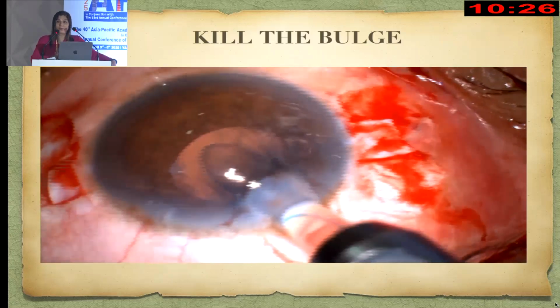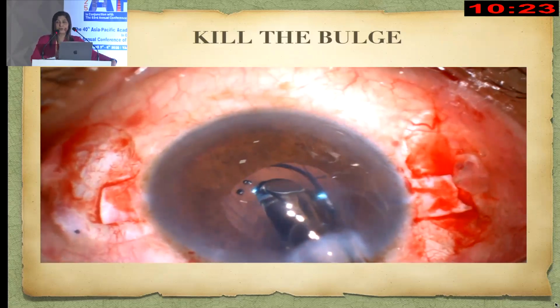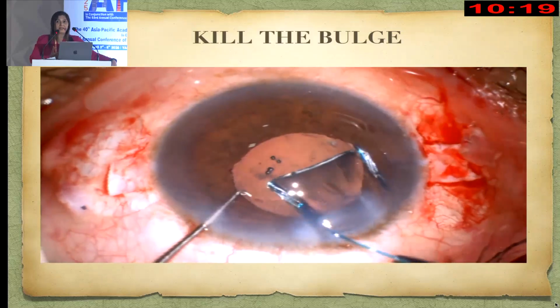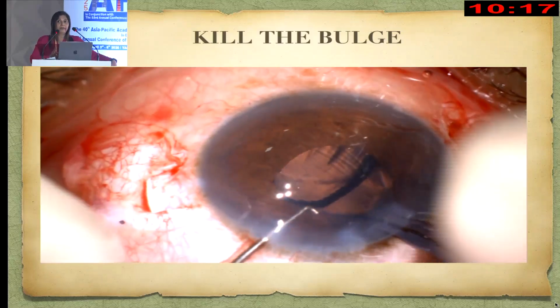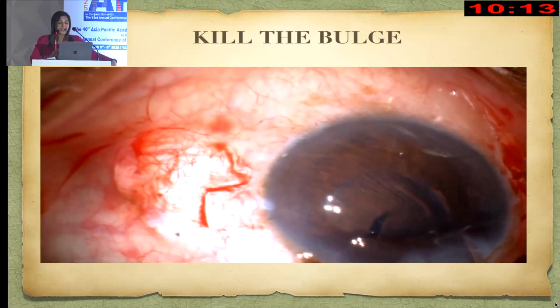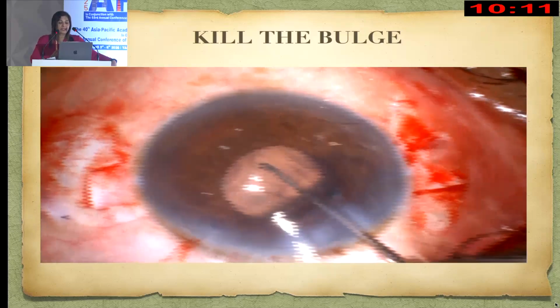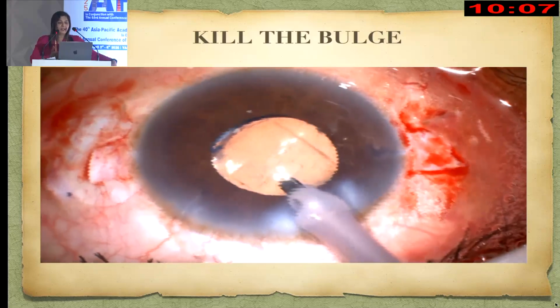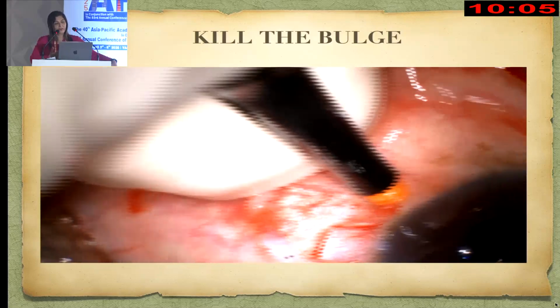Now this was a traumatic case. It was not a case of progressive zonulopathy. So you can just place a CTR, and you can see how stable the intraocular lens is after doing this surgical procedure. Now in this case, even after placing this, when you're doing an IA, you again see that there is a decentration.